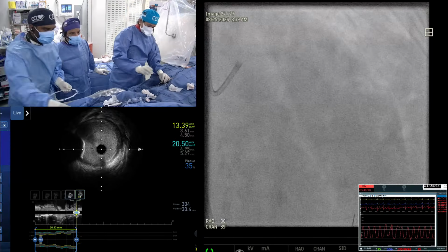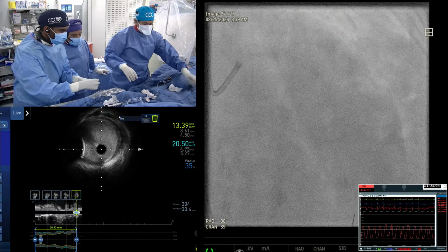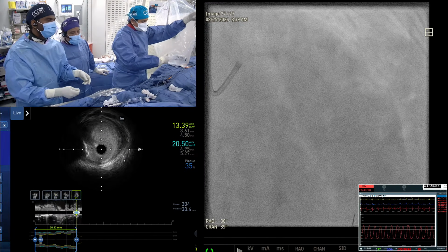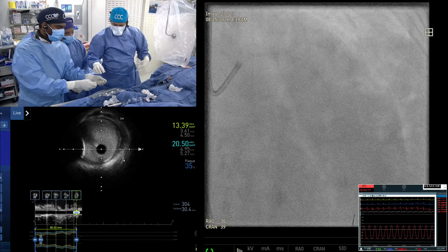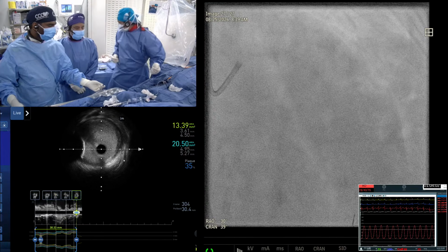Look. Of the ablative techniques, what we can say based on the various trials is that for calcific lesions, rotational atherectomy and IVL have a similar MSA and similar acute success, except IVL will have a slightly lower perforation rate.